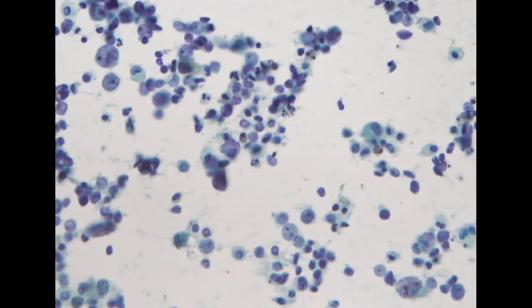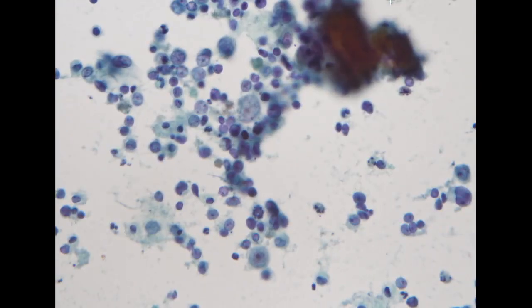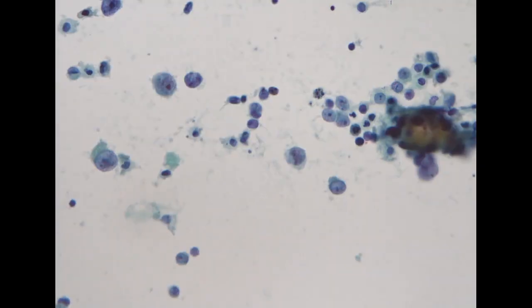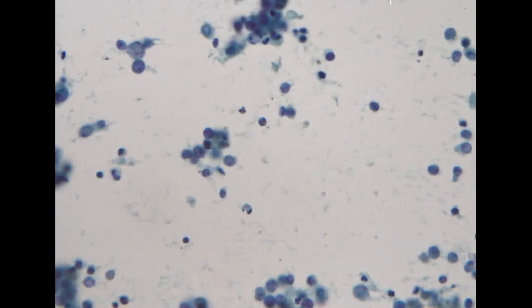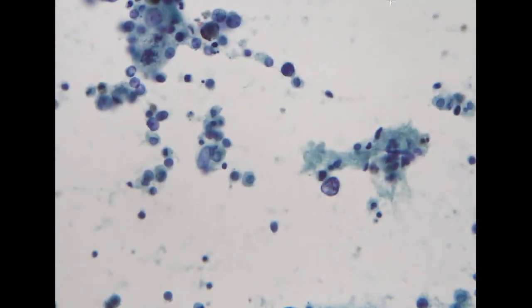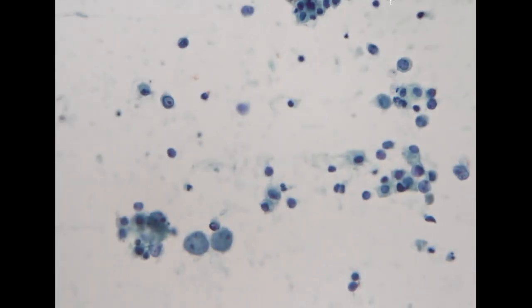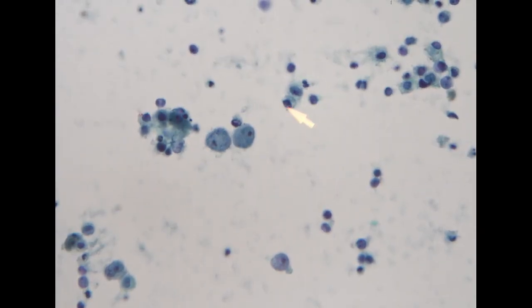Because this is a pancreatic cancer, we are usually more familiar with the well-differentiated, well-formed tubule glandular pattern. But for this case, it is mixed with very big cells and medium-sized cells, and the features are not as striking as adenocarcinoma. So it's likely a very poorly differentiated adenocarcinoma.